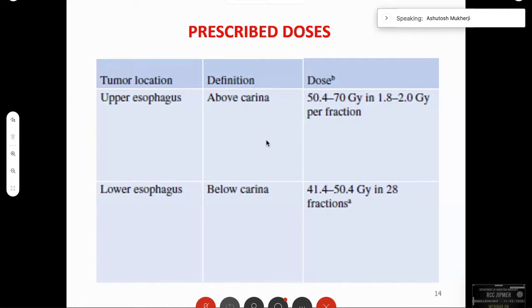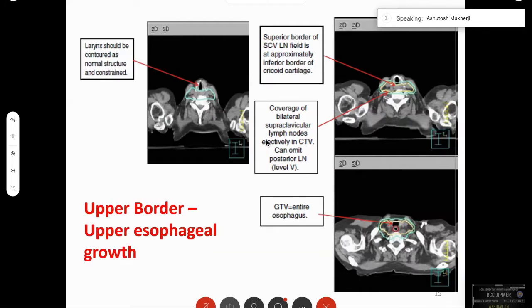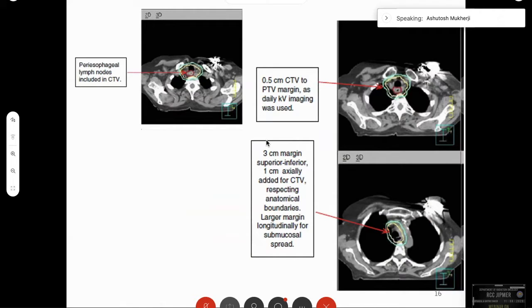For contouring: first contour the larynx as a normal structure. The superior border of the supraclavicular lymph node field is at the inferior border of the cricoid cartilage. The bilateral supraclavicular nodes are contoured electively in the CTV. The GTV should cover the entire esophagus. As you can see from these photos, the GTV is the small red contour, supraclavicular nodes are covered in the CTV, and then there is the light blue CTV. As you go down, the periesophageal nodes are included in the CTV.